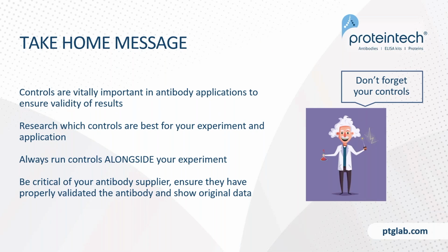The take-home message from this talk is that controls are vitally important in antibody applications to ensure the validity of our results. Research which controls are best for you and your experiment and that application. Always run controls alongside your experiment. Be critical of your antibody supplier and ensure that they have properly validated the antibody before it reaches your hands and can show their original data.